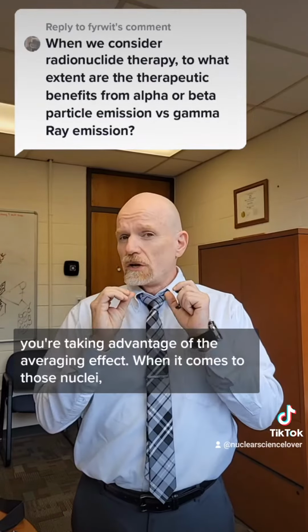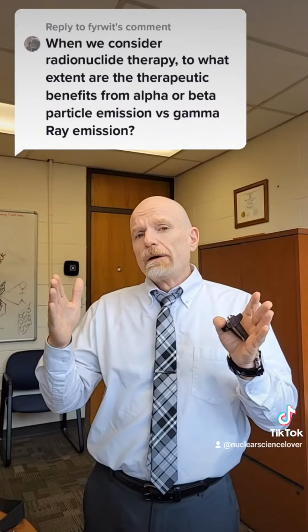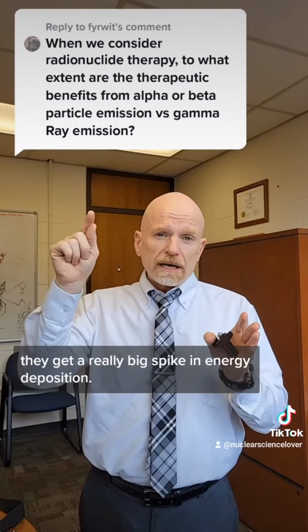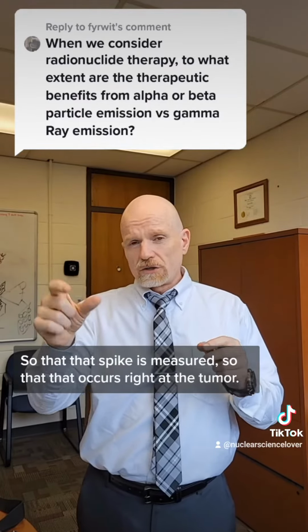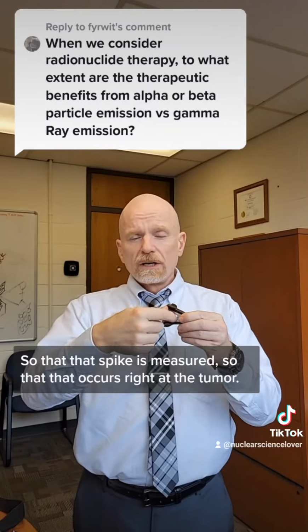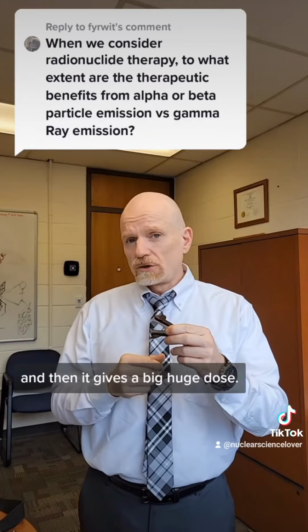But when it comes to those nuclei, they have what's called a Bragg peak. So at the end of their range, they get a really big spike in energy deposition, so that spike is measured so that it occurs right at the tumor. So you get a smaller energy deposition until you hit the tumor, and then it gives a big, huge dose.